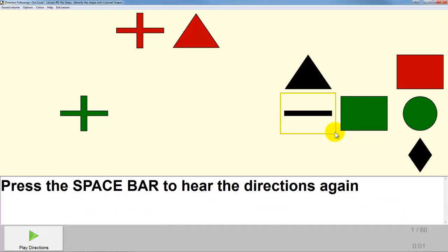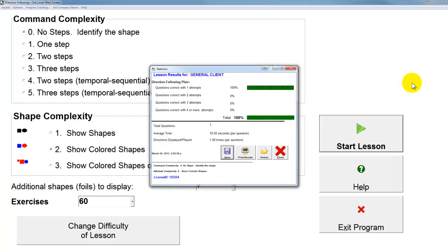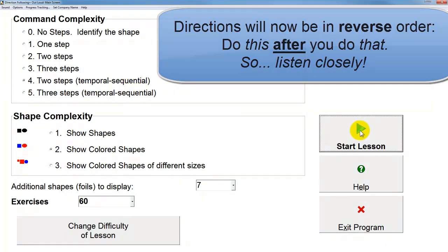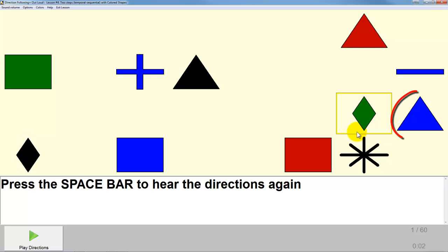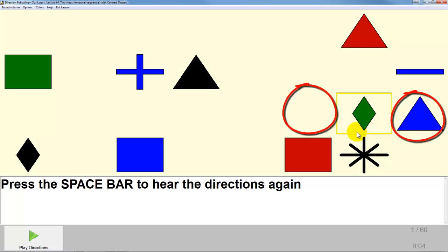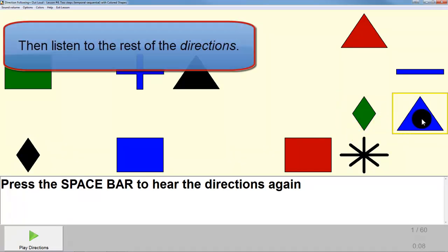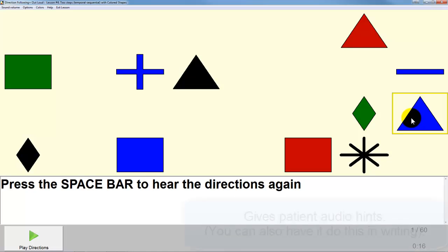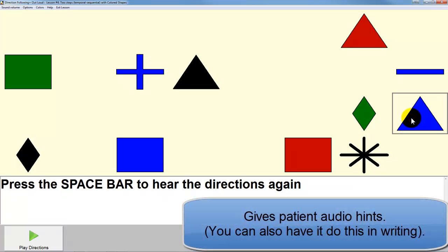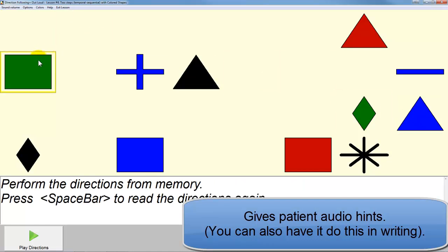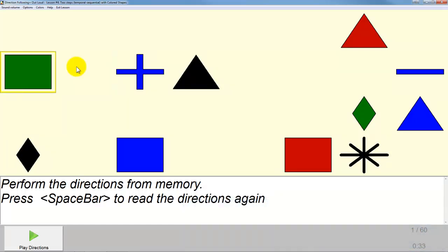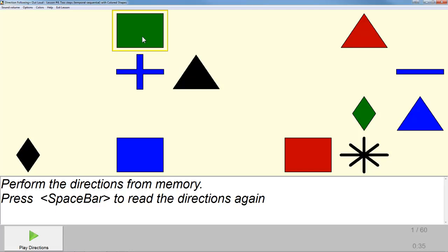Select the red square. Put the blue triangle to the left of the green diamond. Put the green square below the blue cross. You are performing the directions in the wrong order. That is a blue triangle — you should be moving the green square. You are moving the shape to the wrong location.